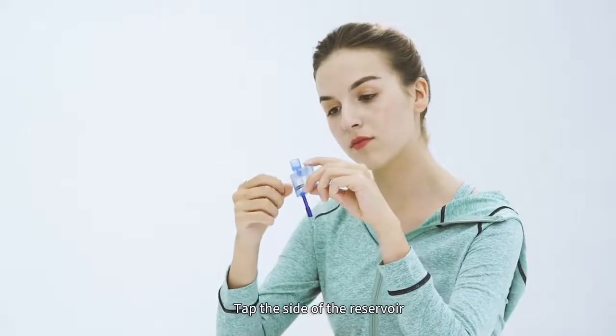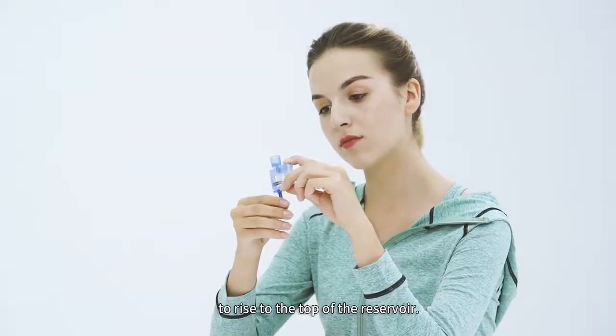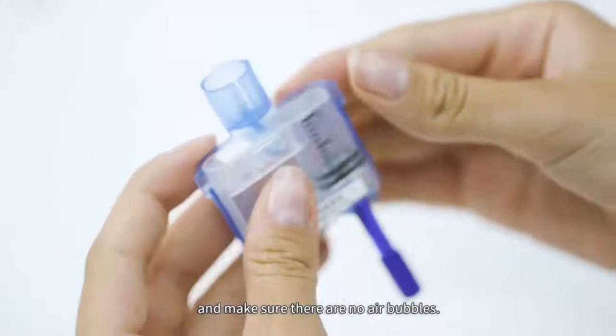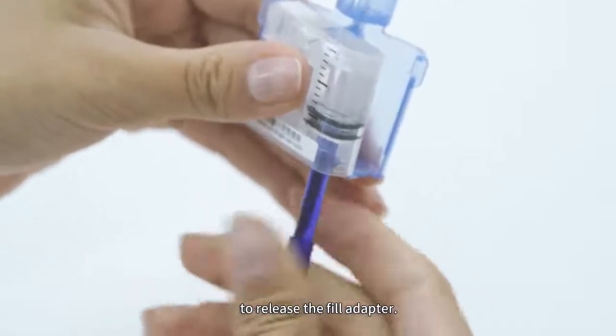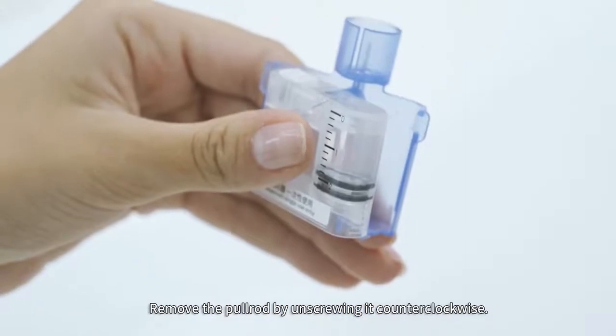Tap the side of the reservoir to encourage any air bubbles to rise to the top of the reservoir. Push the pull rod slowly to eject the bubbles and make sure there are no air bubbles. Pull the two release tabs away from the reservoir to release the fill adapter. Remove the pull rod by unscrewing it counterclockwise.